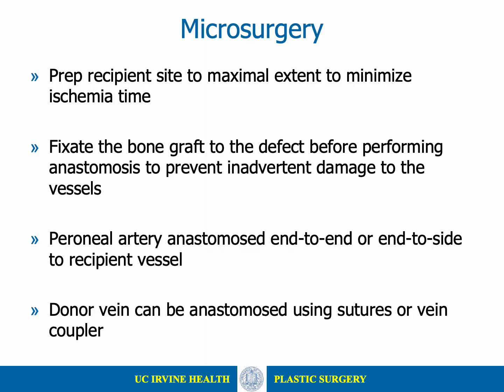Attention is then turned to the recipient site, which is prepared to the maximum extent before pedicle division to minimize ischemia time. The bone flap is fixated to the defect before performing the anastomosis to prevent inadvertent damage to the vessels. The microscope is then brought in, and the peroneal artery is anastomosed end-to-end or end-to-side to a recipient vessel. The donor vena comitantes can be anastomosed with sutures or a vein coupler.